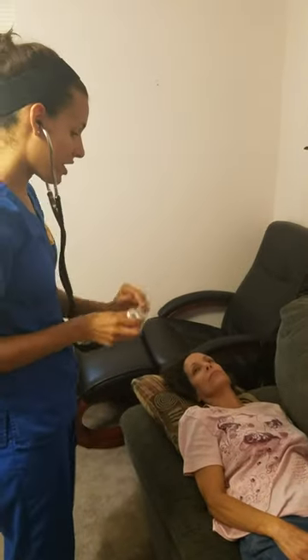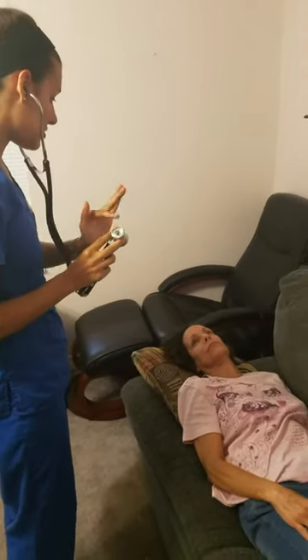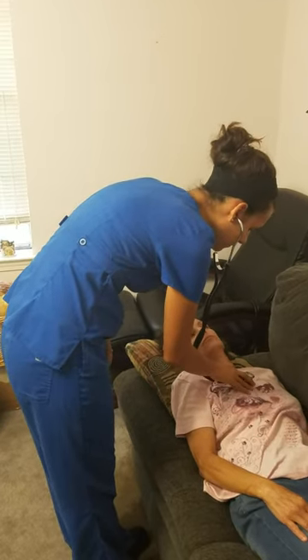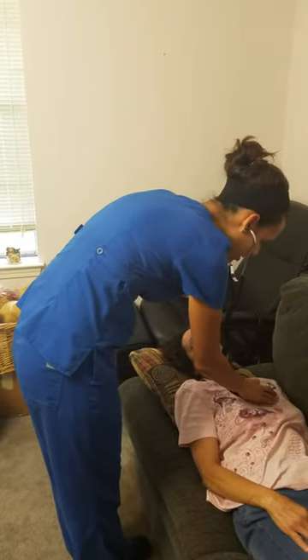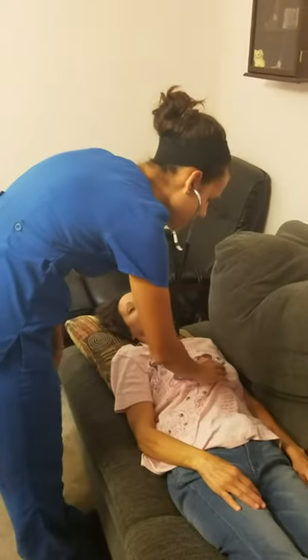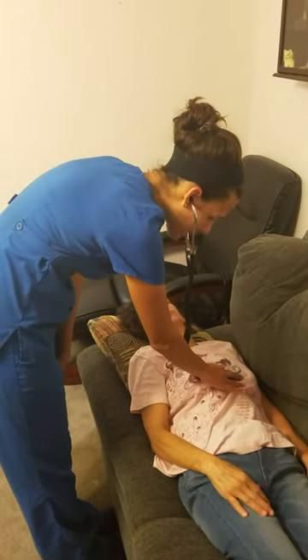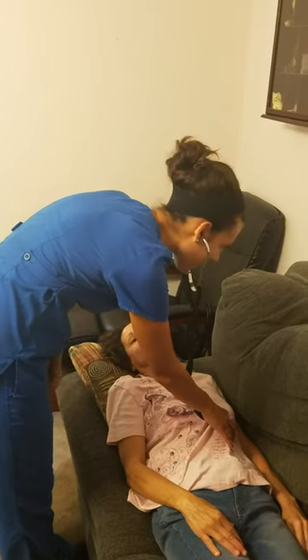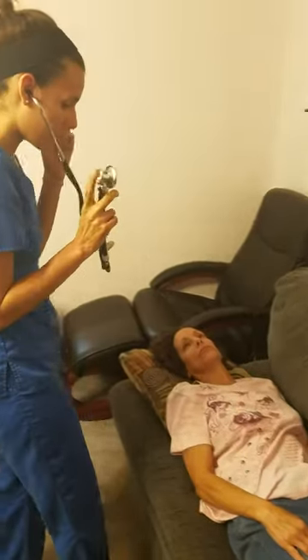Now I'm going to go ahead and auscultate the different areas of your heart, first using the diaphragm of the stethoscope, then moving to the bell, because you can hear different sounds using the different parts of the stethoscope. Right sternal border, second intercostal space — aortic area. Left sternal border, second intercostal space — pulmonic area. Third intercostal space, left sternal border — Erb's point. Fourth intercostal space, left sternal border — tricuspid area. And then the mitral area — fourth or fifth intercostal space, left mid-clavicular line. Then I would go back and listen as well with the bell of my stethoscope.